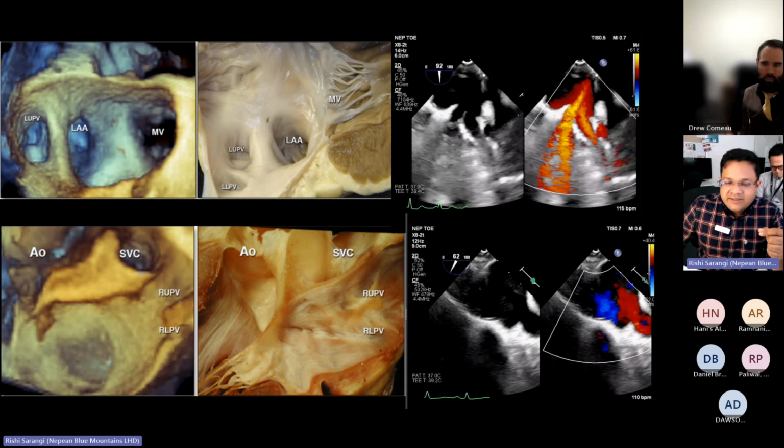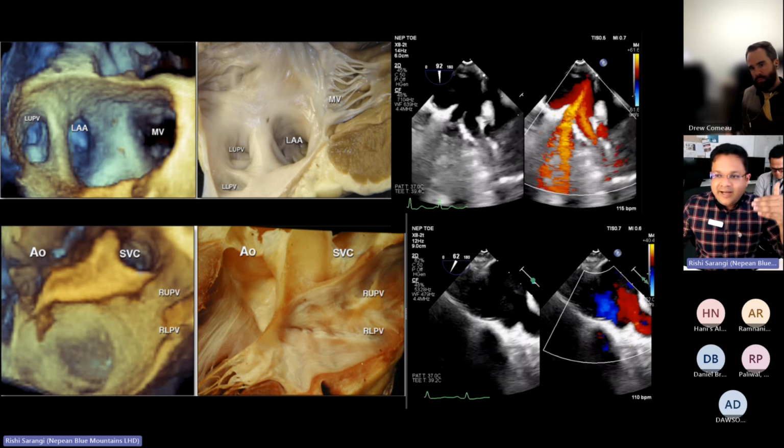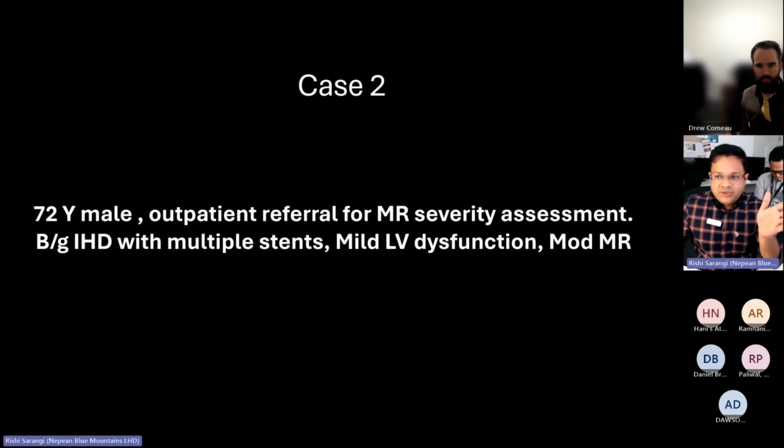The left pulmonary veins are usually encountered around 110 degrees. The right pulmonary veins are usually encountered around 45 to 60 degrees. But there's no hard and fast rule. You can do some manipulations. Always look at the image, and don't be sticky about those angles.